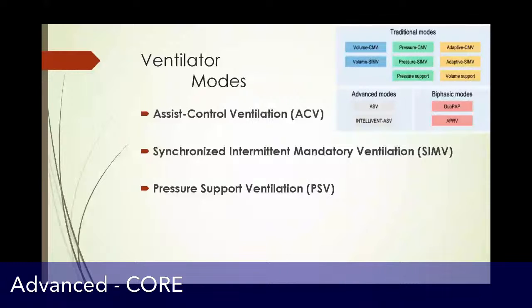So the 3 common ventilator modes are assist control ventilation, the synchronized intermittent mandatory ventilation, or SIMV, and then pressure support ventilation, which is also combined with SIMV often.